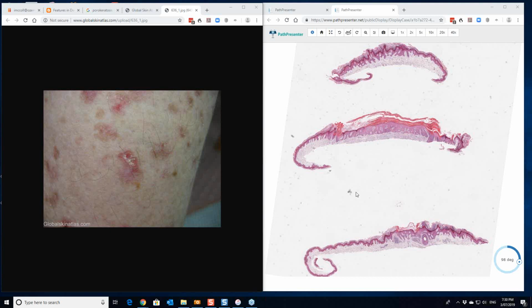If they only biopsy the middle, or the punch, sometimes it's just reported as a lichenoid keratosis. You need to get the lesion. This one's been shaved, obviously, to show the cornoid lamella here. They heaped up inward pointing areas of heaped parakeratosis in DSAP, porokeratosis.